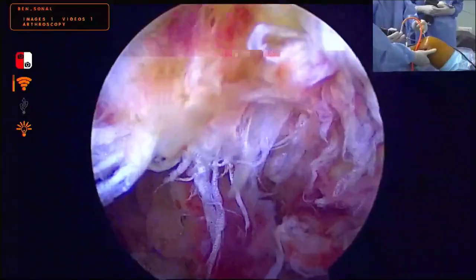Just a minute. So this is okay. So put it in. So there are three loop-ins. They are holding it nicely. Now I'll be inserting my LR anchor into the footprint.